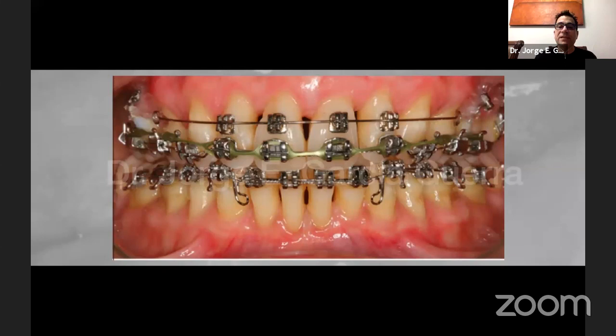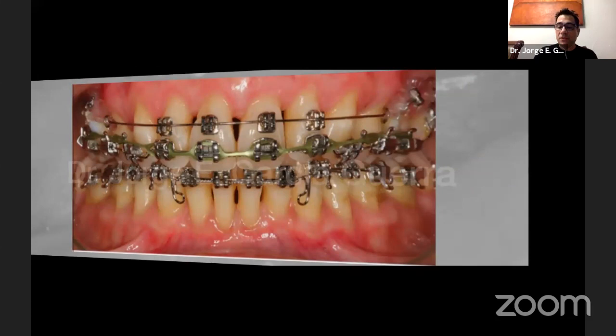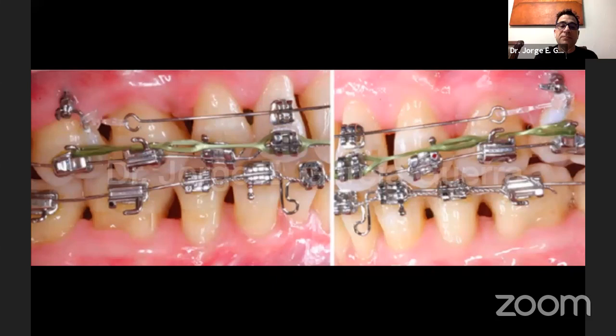Now you can see here, in the lateral images of this patient, that it had the four upper bicuspid extractions. It has a lower first bicuspid, and on the upper it was missing all the bicuspids. So they were using these mini implants and this round wire with some brackets that were placed on the gingival section of the incisors, so that the force goes more to the center of rotation. And in the lower, you can see the brackets that are placed very incisally. So when we see this, we can see that there are a lot of things that we could have done differently. But the doctor was using a lot of imagination and a whole lot of biomechanics. So that's what we should do.